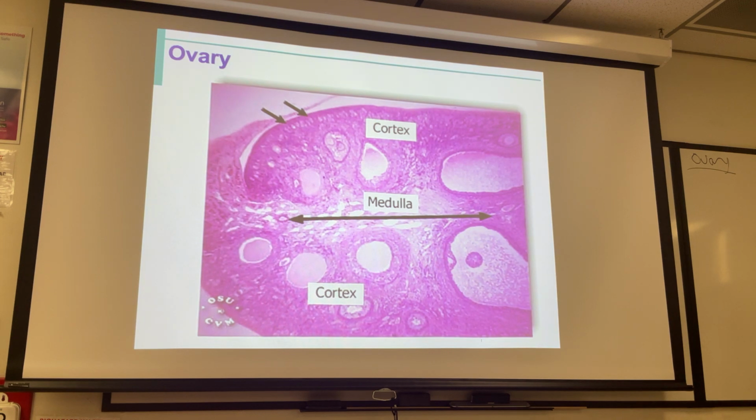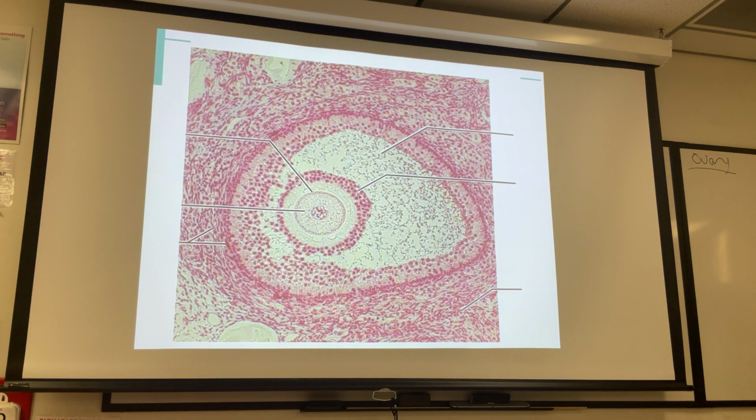So that one on the bottom, right? Yeah, this one would be a mature follicle, exactly. That probably is as well, we just don't have the egg in the section that they took. So what we're looking at is just this one. When we get to the reproductive system, we'll learn about all those other types of follicles. But for right now, we're just focusing here. All right, excellent. Now, any other questions on this?